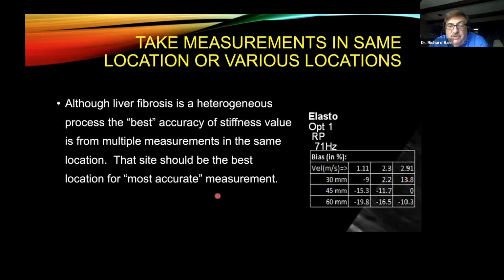And what I have here on the right is something called a bias table. There was an organization or committee, if you will, that is RSNA, some clinicians, the FDA, and some research scientists and all of the vendors. And we developed some liver phantoms that had stiffness values of 1.1, 2.3, and 2.9 meters per second. And we did serial measurements on all of the vendors we had at that time at 3 centimeters, 4.5 centimeters, and 6 centimeters. And this is from the first round that we did this. And the numbers in these little boxes tell you how this system did.